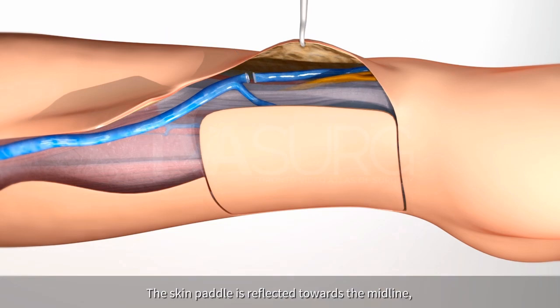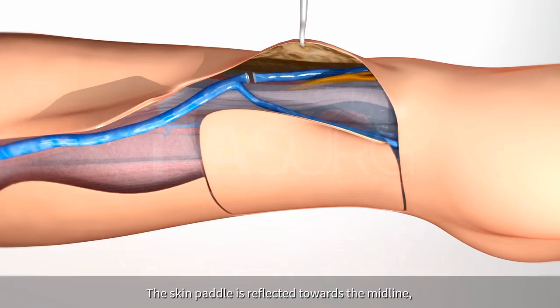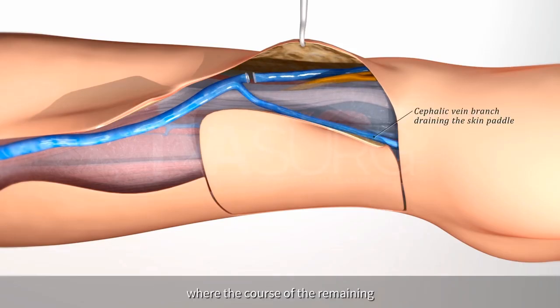The skin paddle is reflected towards the midline, where the course of the remaining cephalic vein branch is traced and divided at the wrist.